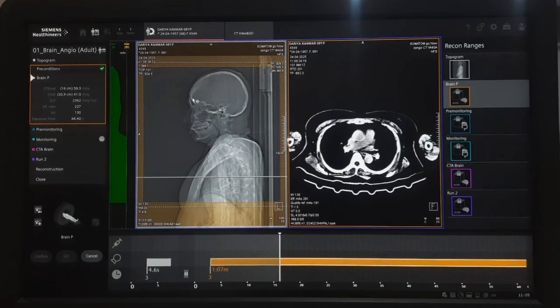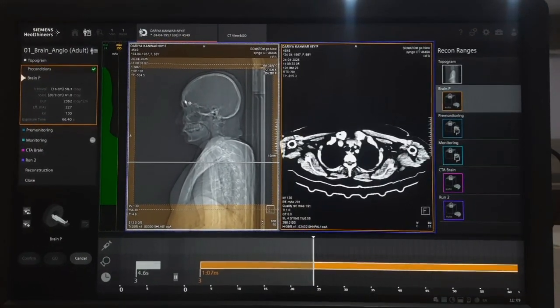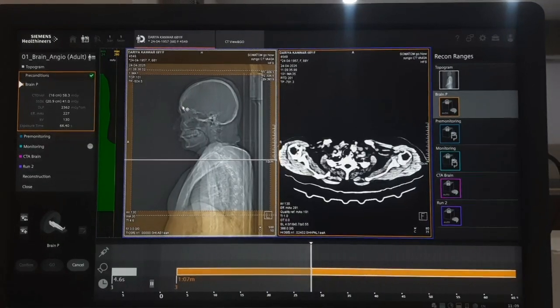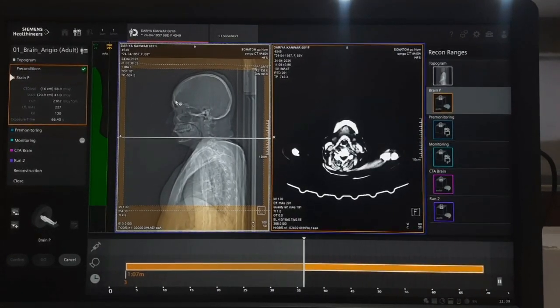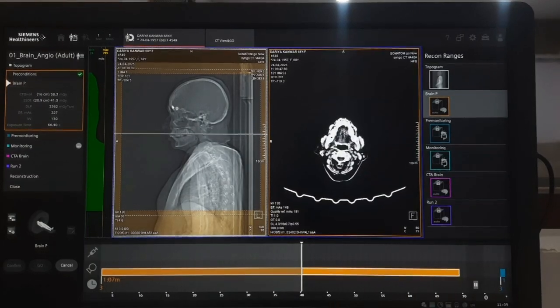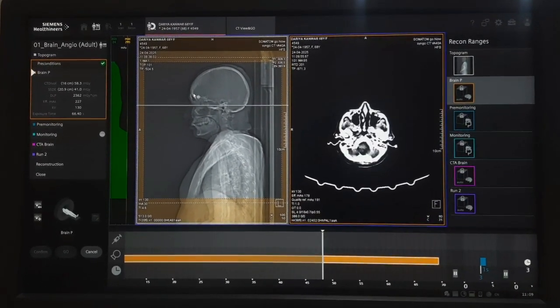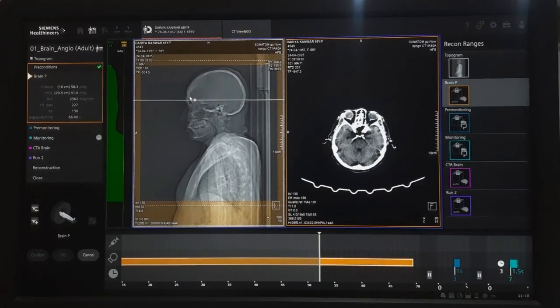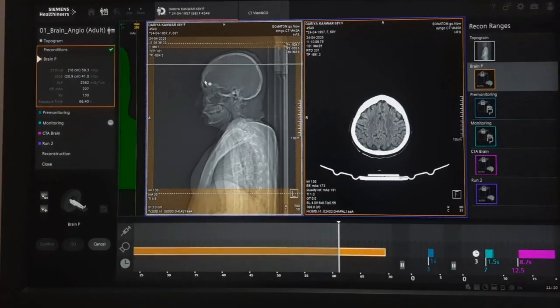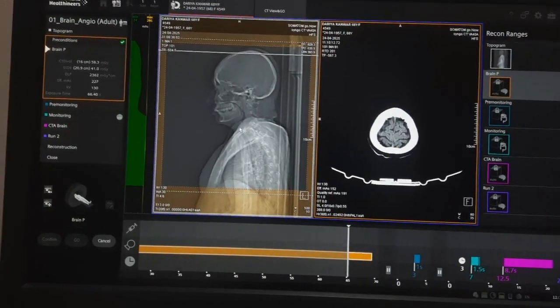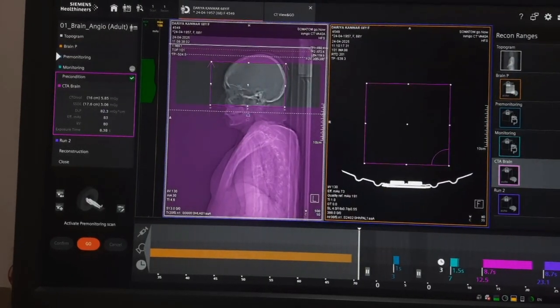Watch the scan carefully. Now the brain scan is completed. Initiate the CTA brain run.